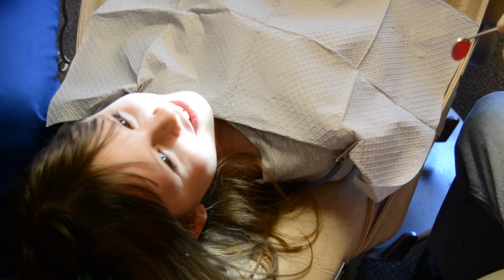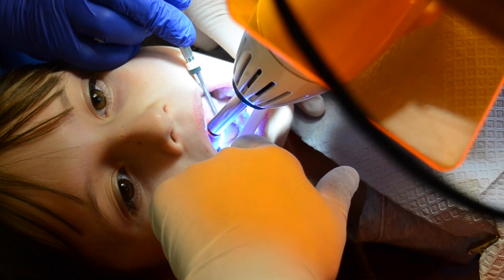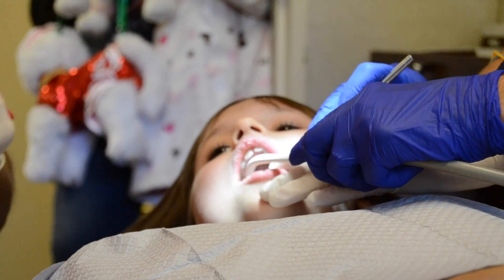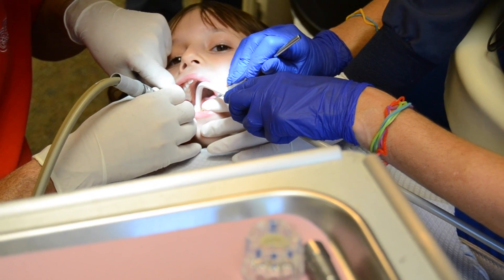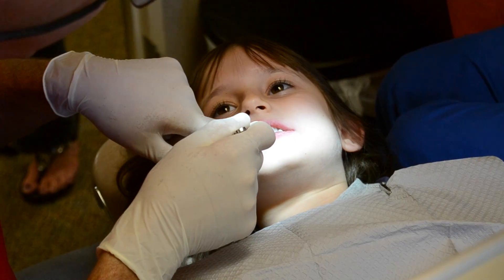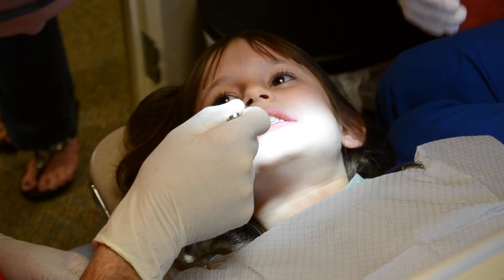You're kidding me — it's actually done. Okay, check the other side. I'm trying to bite together, and now tap up and down nice and hard. And then kind of grind your teeth side to side.